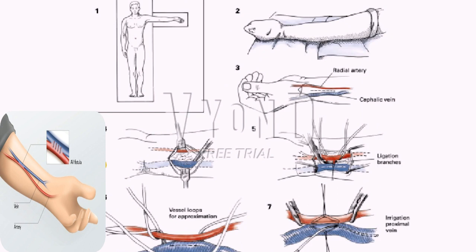The surgeon palpates the radial pulse and the location of the incision is planned. A vertical incision is made in the forearm close to the wrist and lateral to the radial pulse. Once the incision is carried to the deep subcutaneous tissue, self-retaining retractors are placed. Sharp and blunt dissection are used to identify the cephalic vein. The vein is skeletonized for a distance of 2 to 3 cm, encircled with vessel loops proximally and distally, and side branches are ligated with 4-0 silk.